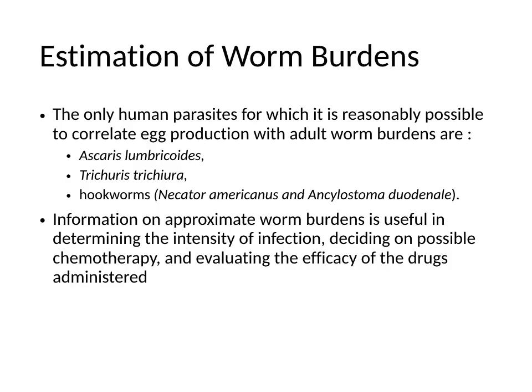Estimation of worm burdens. This technique is used principally for Ascaris lumbricoides, Trichuris, and hookworms. Estimation of burdens is useful in determining the intensity of infection, deciding chemotherapy, and testing the efficacy of the drugs.